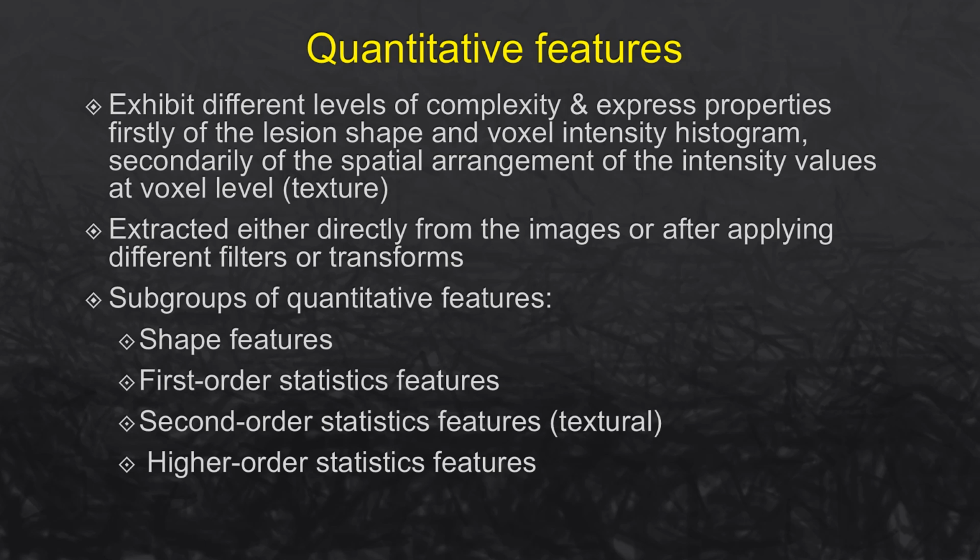These are histogram properties reporting the mean, the median, the maximum, minimum values of voxel intensities in an image, as well as the skewness, which is asymmetry, the kurtosis, which is the flatness of the lesion, uniformity, and the randomness or entropy. Second order statistics are more like textural features, and these are obtained by calculating the statistical interrelationships between predetermined distance along a fixed direction of the what's called the gray run length matrix, or the GLRM, and quantifying consecutive voxels with a similar intensity along fixed directions.